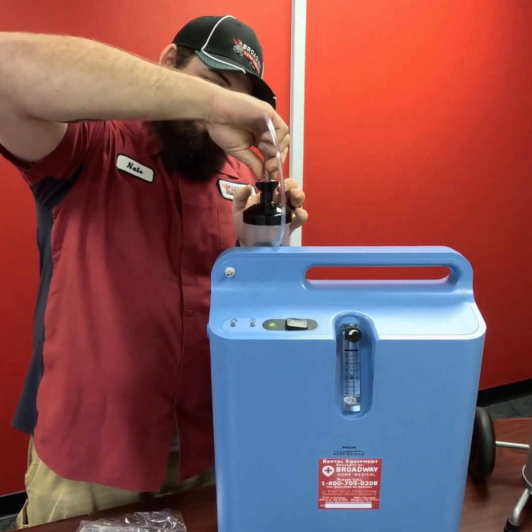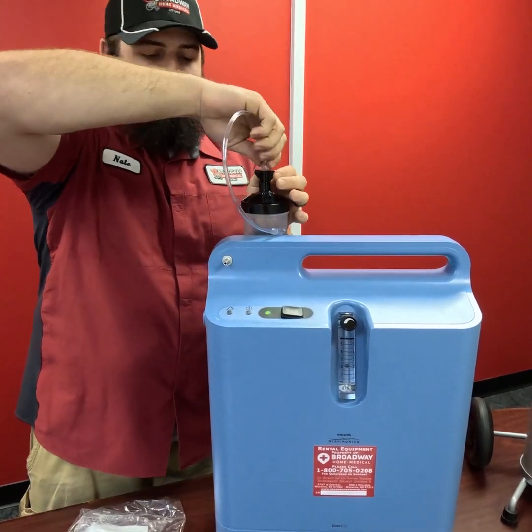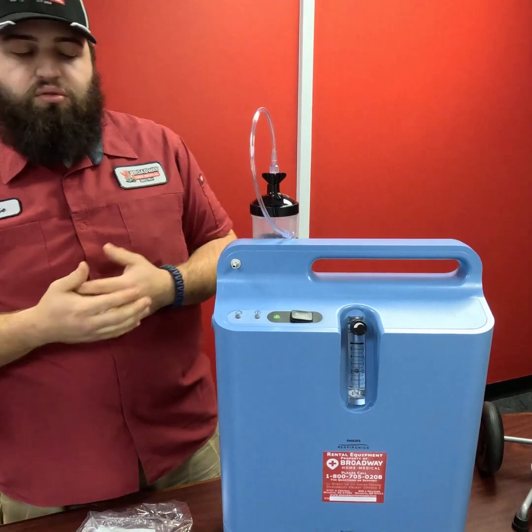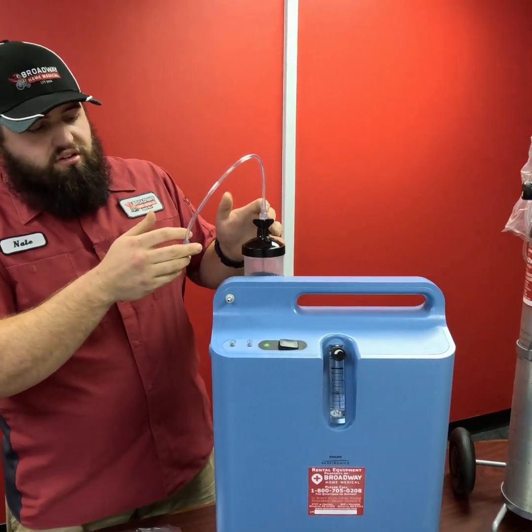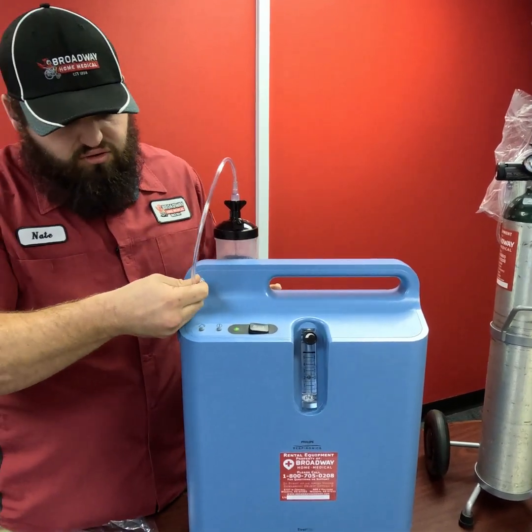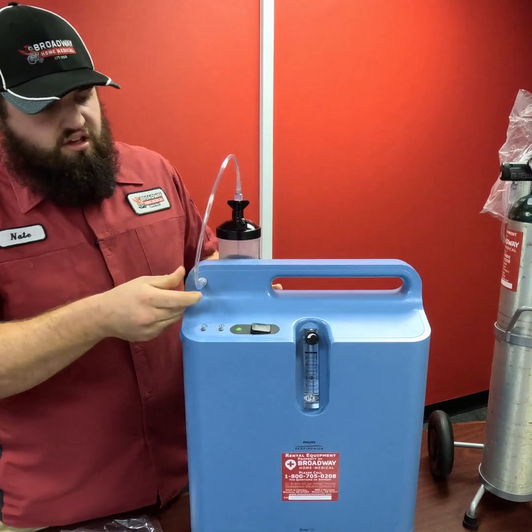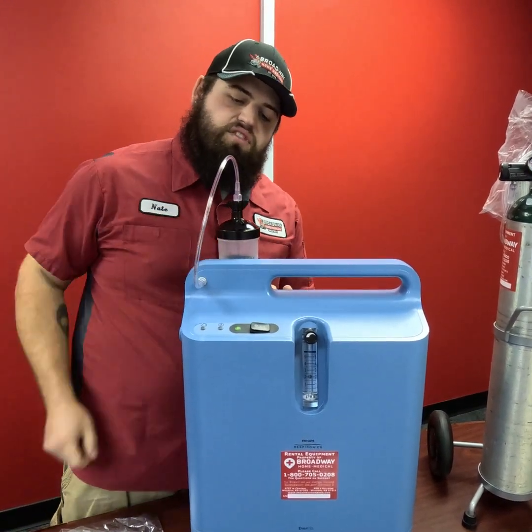And like I said before, these things are very, very easy to cross thread. So we do want to be very careful to make sure that we're not cross threading that. Now once we have that threaded on, we can take this female end and plug directly into the machine there. And from there, we can actually run all of our hoses off of the lid there.